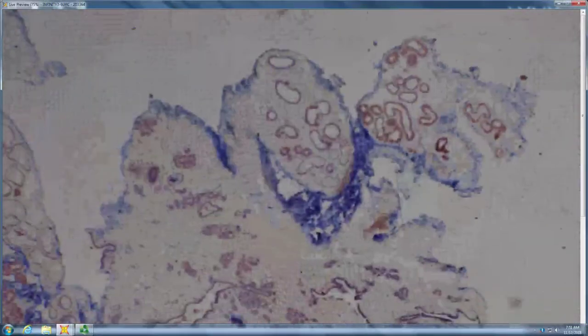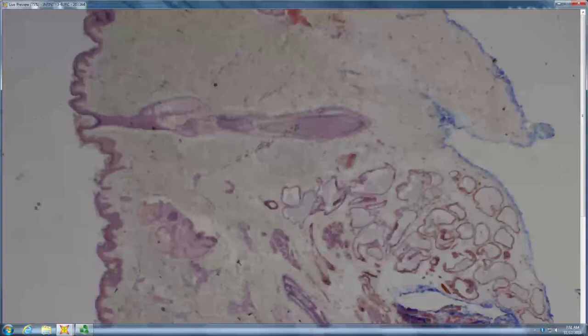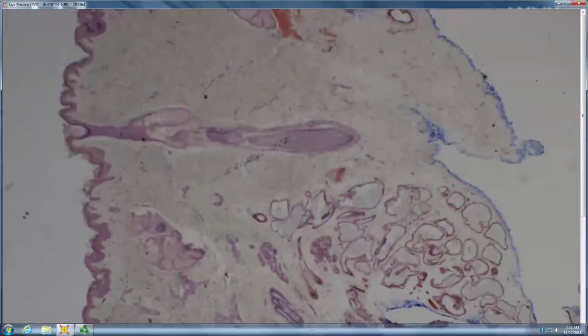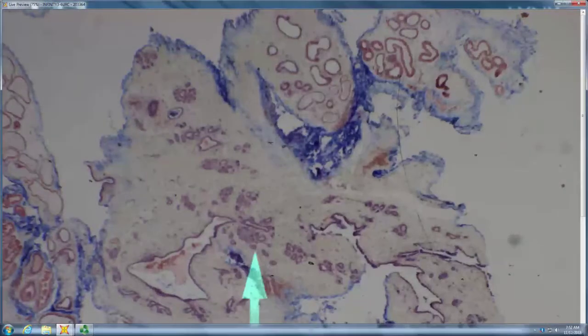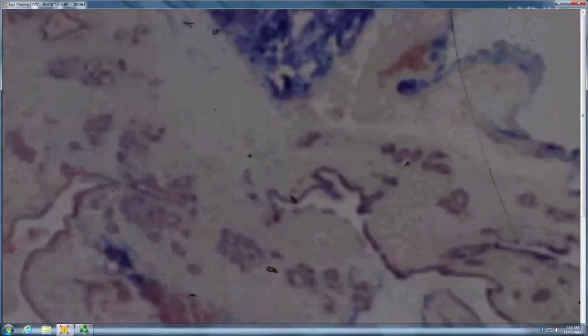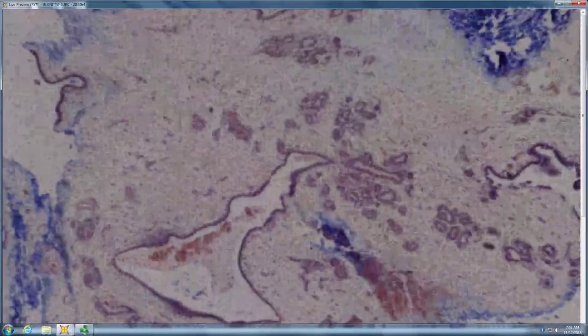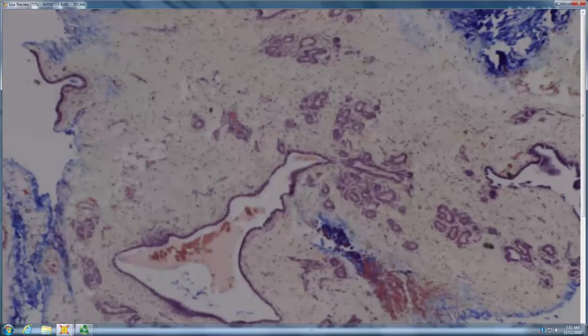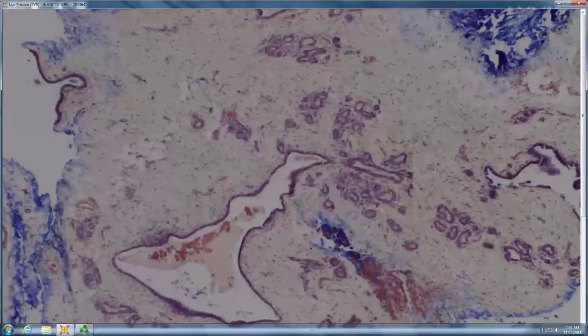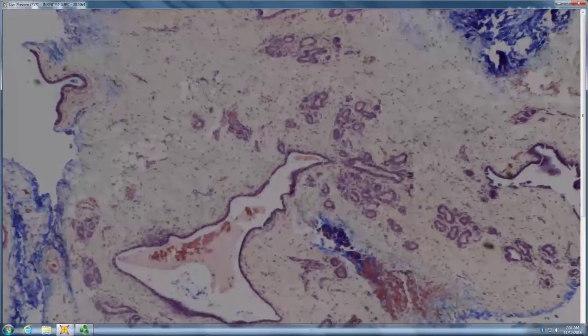This is from a mole, a bothersome mole in the axilla. Looks like a lot of cave-like, cyst-like structures. So maybe hydrocystoma. Kind of like a hydrocystoma. It's certainly a modified apocrine type gland. So what would be that mole or that mass in the axilla that you just excised?